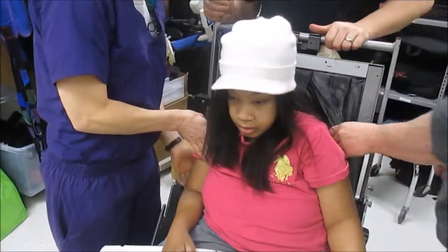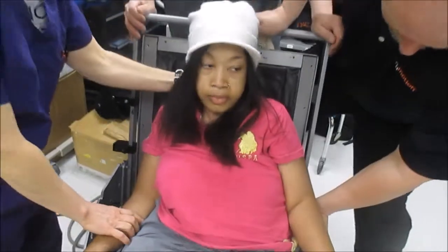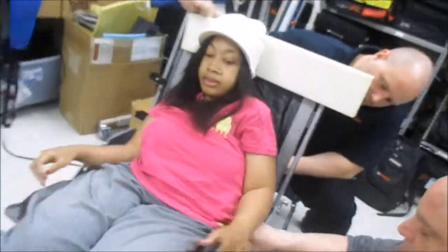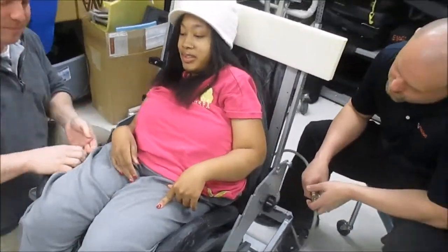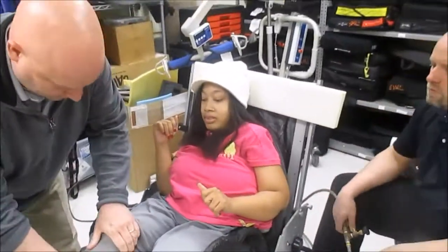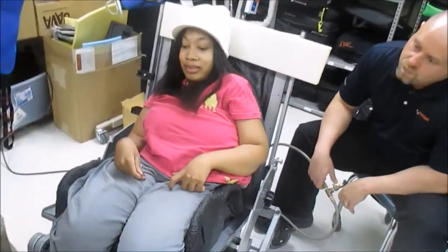My biggest concern is right here. Let's go ahead and tilt it back. Start pushing now. She looks real nervous. Do you feel like you're in a good position there, or do we need to close that back angle? When we say close back angle, we say like this.